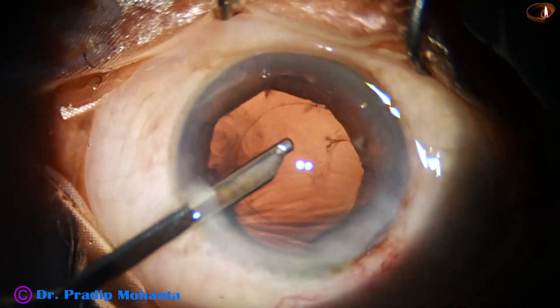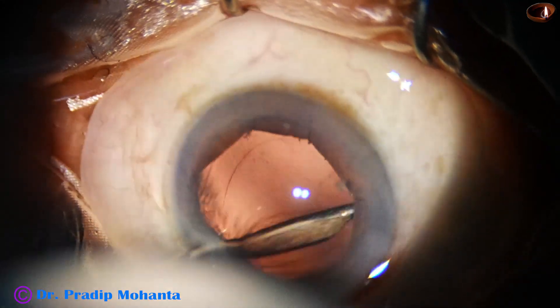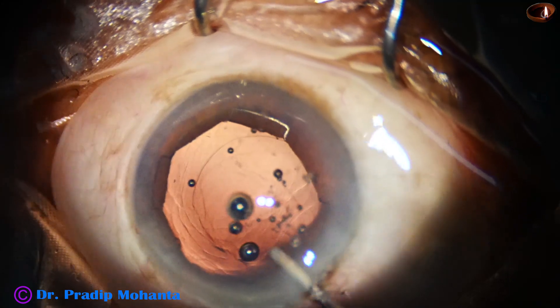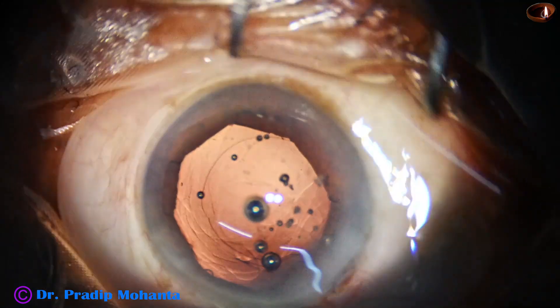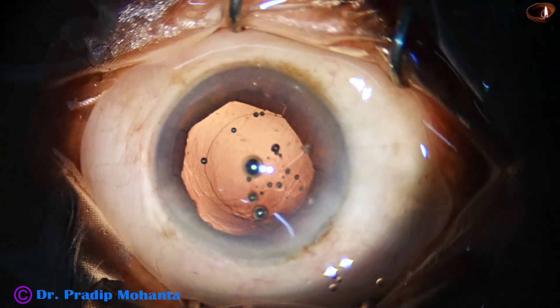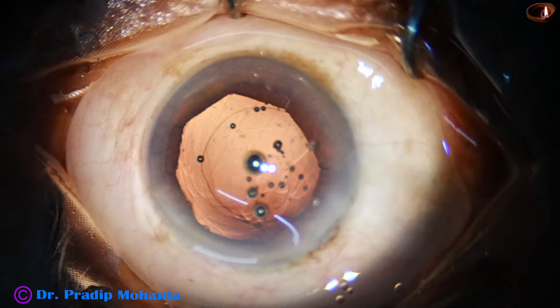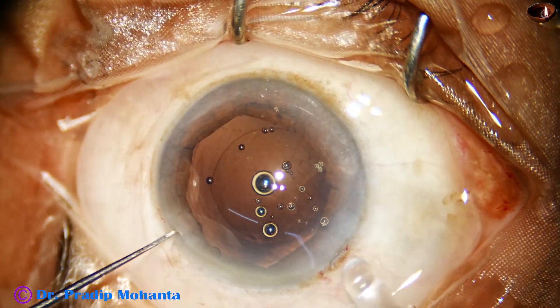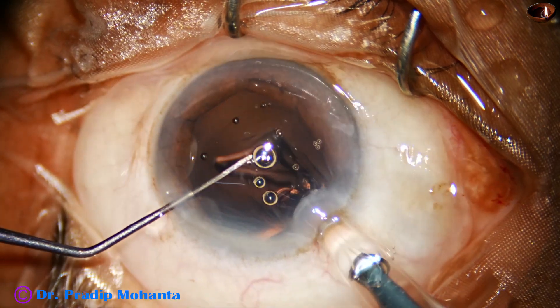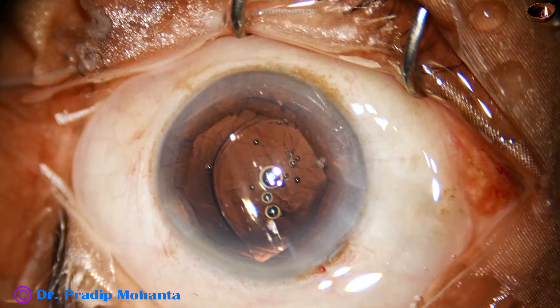I am using a Simcoe for removing the cortex. Visibility is excellent and in no time we clean the cortex. We can see the rexis margin all around except the area from 7 o'clock to 9 o'clock — that means this flange has tucked the rexis margin also, but it didn't cause any problem because the rexis was of adequate, rather larger, size initially.